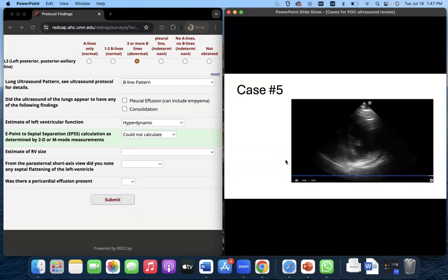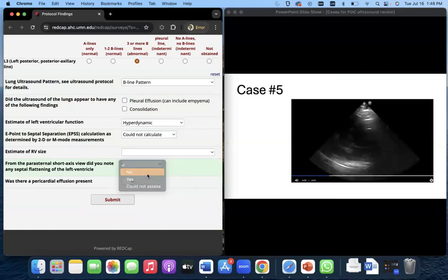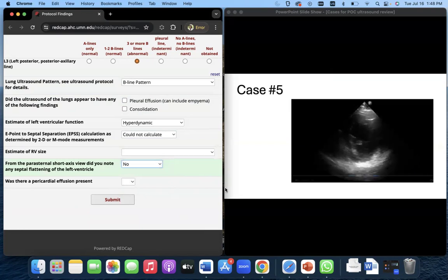Yeah, I remember this patient was hard to. So then here's our parasternal short axis. The heart again is kind of swinging in and out. You can see actually some lung up there in the upper right-hand corner as the heart moves into view. It's difficult to really say much about this particular parasternal short axis view, but in combination with what we know from that parasternal long axis, we can see that there is quite a bit of movement, quite a bit of collapse.